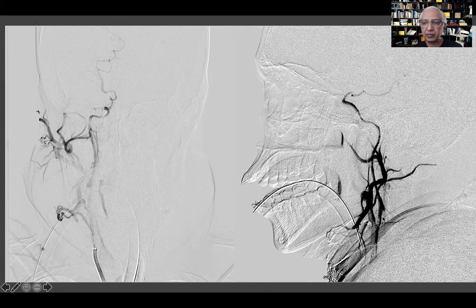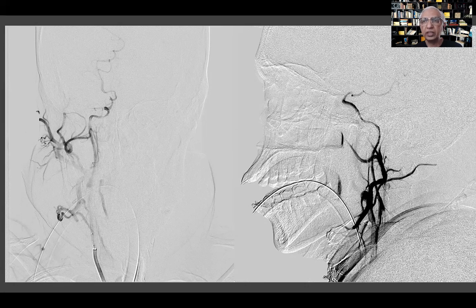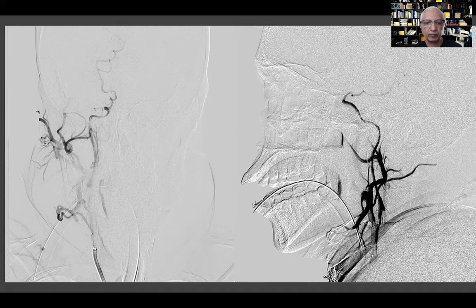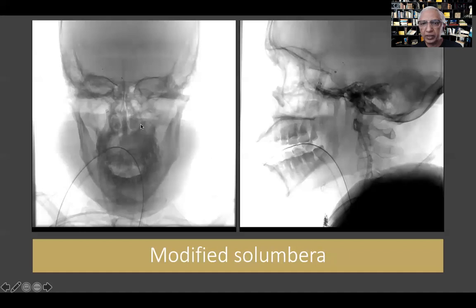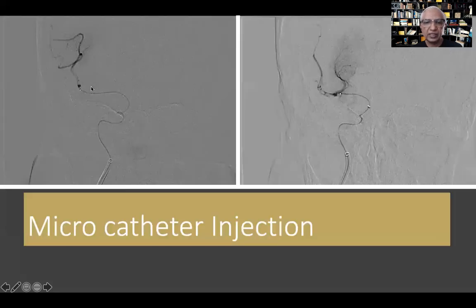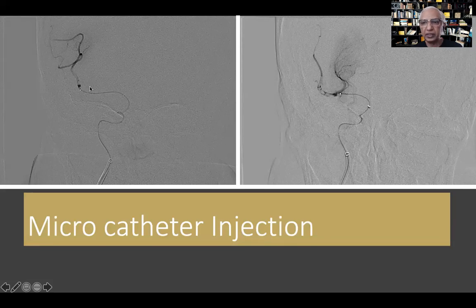There is an occlusion beyond the posterior communicating artery with some forward flow and an ugly-looking segment where we dilated — this is basically a carotid stenosis that acutely occluded, probably secondary to plaque rupture or thrombus formation. We plan to do a modified SOLUMBRA technique. You can see the long sheath, another suction catheter, and a micro catheter across it. Through the micro catheter injection you can see thrombus extending beyond the MCA bifurcation.